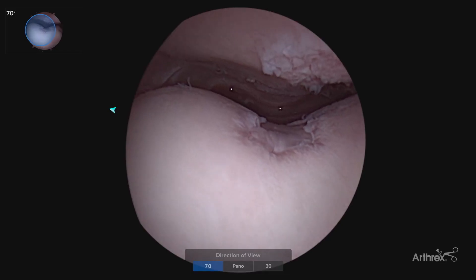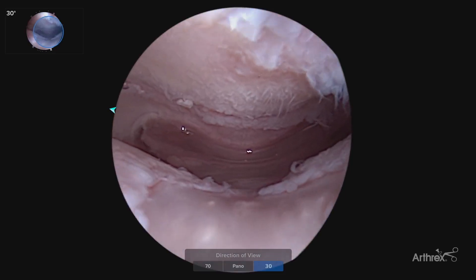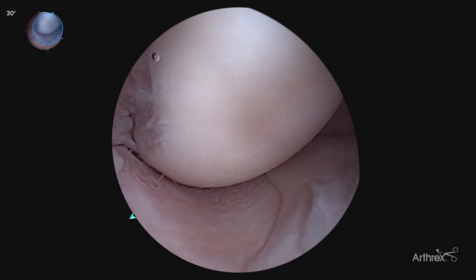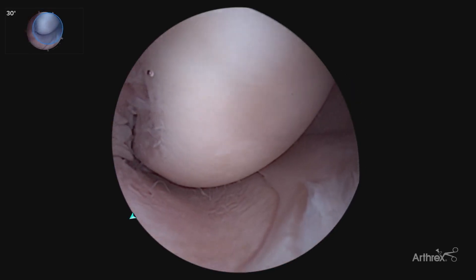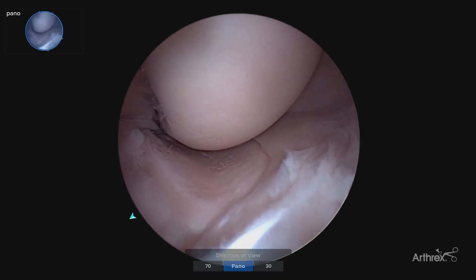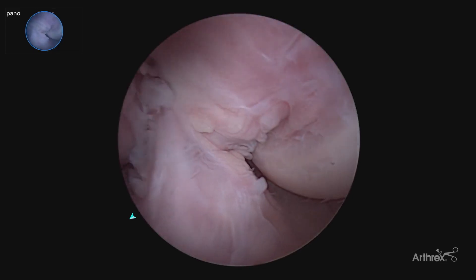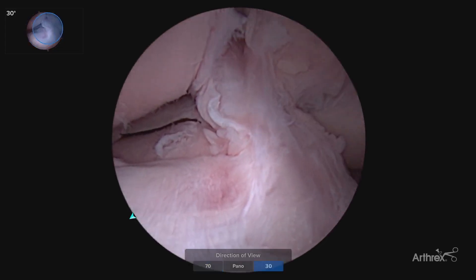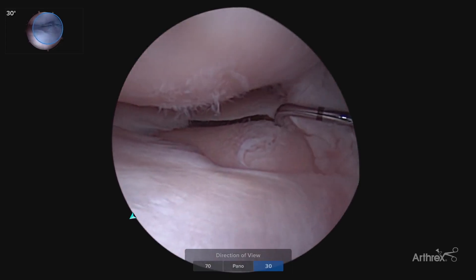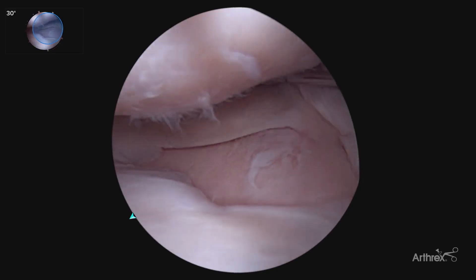Easily transitioning to the 70 degree and the 30 degree scope allows you to maneuver around the joint for your typical diagnostic arthroscopy. As we continue our diagnostic scope, we get our standard 30 degree view. By moving to our panascope, we get a much more global view of the entire condyle, assessing for articular cartilage lesions. Moving over to our notch, we'll go back to our standard 30 degree scope, showing how easy it is to transition with one push of a button, going into our lateral compartment, being able to assess the root.